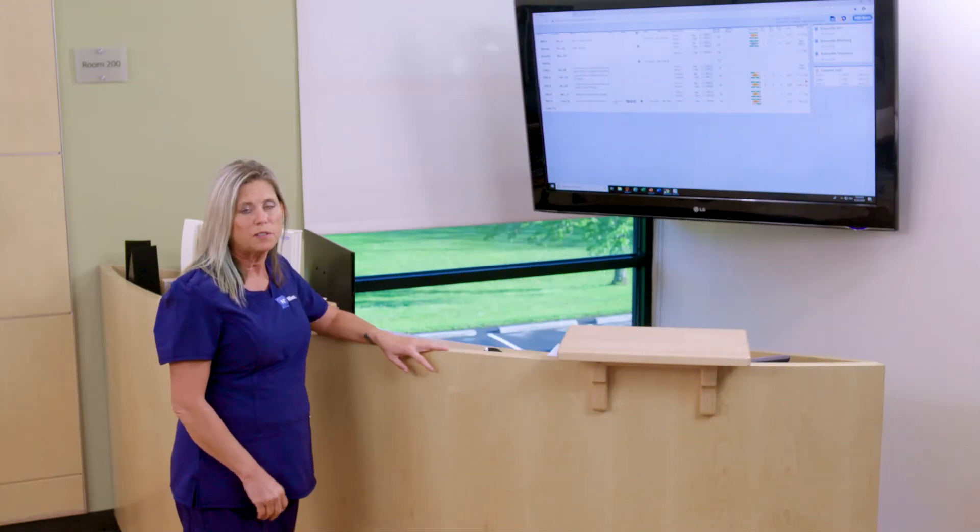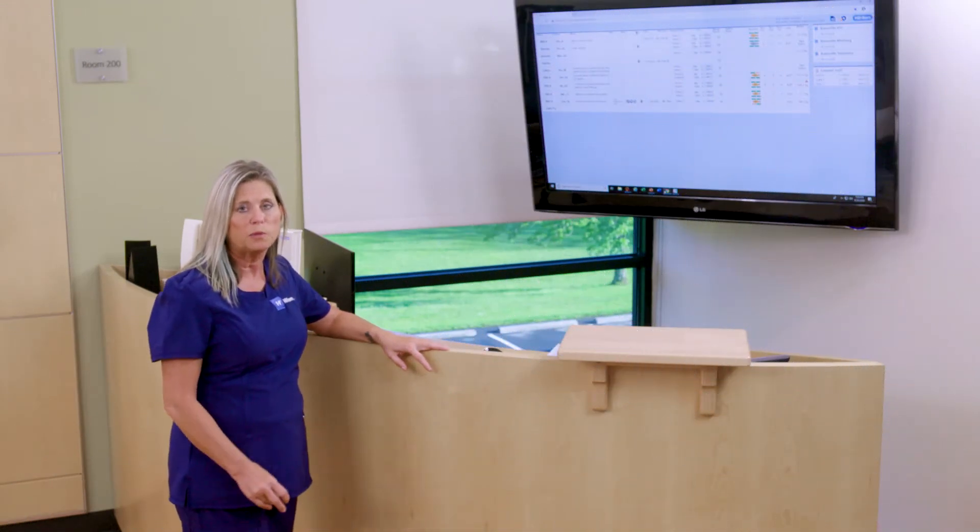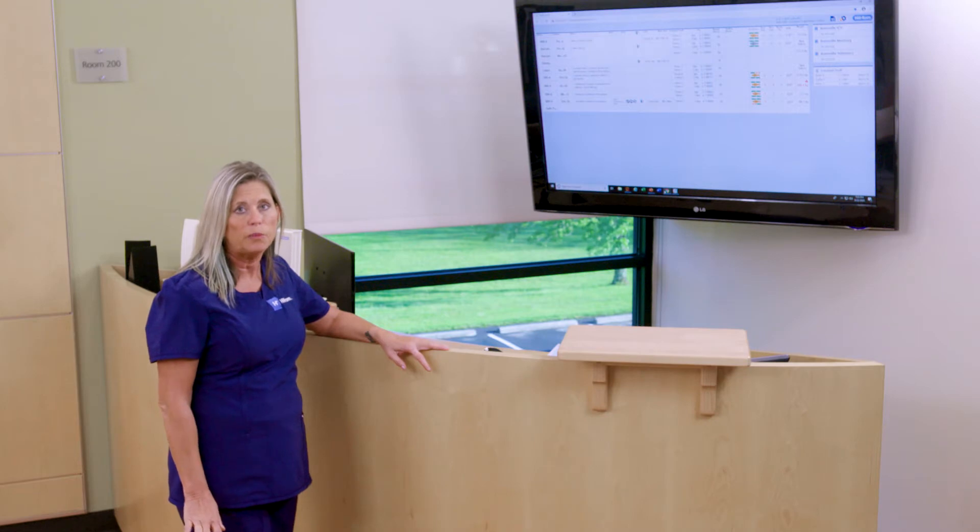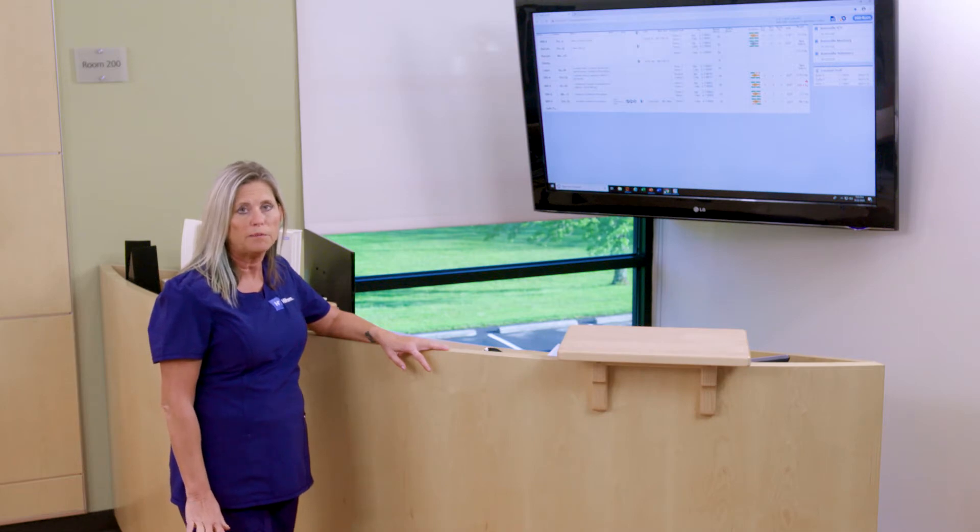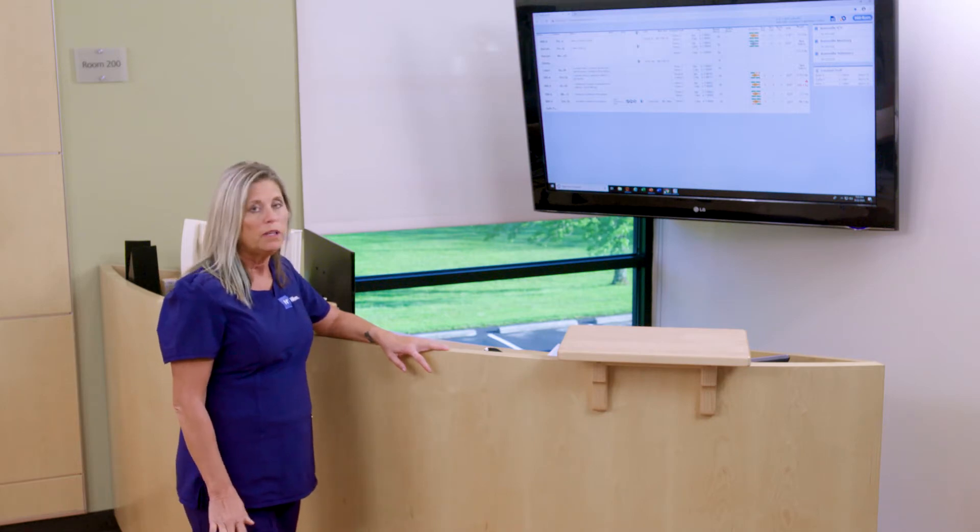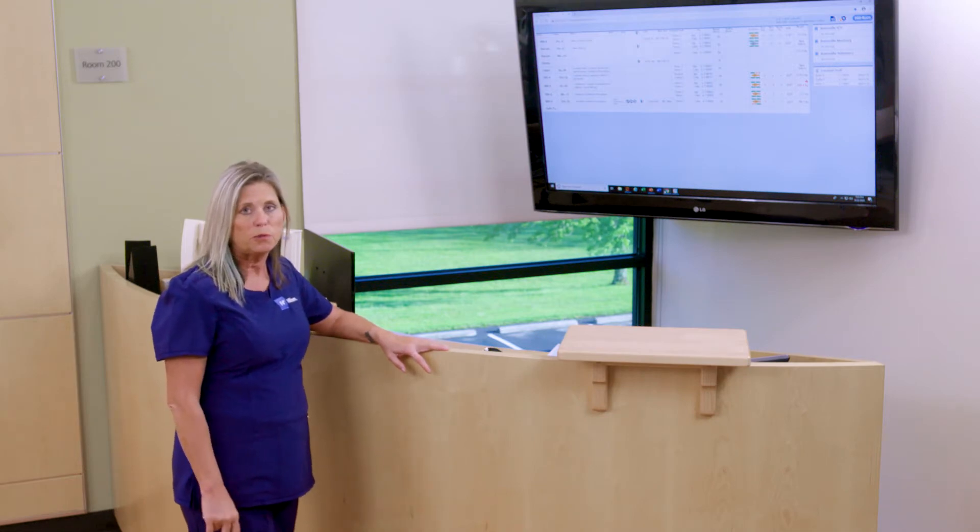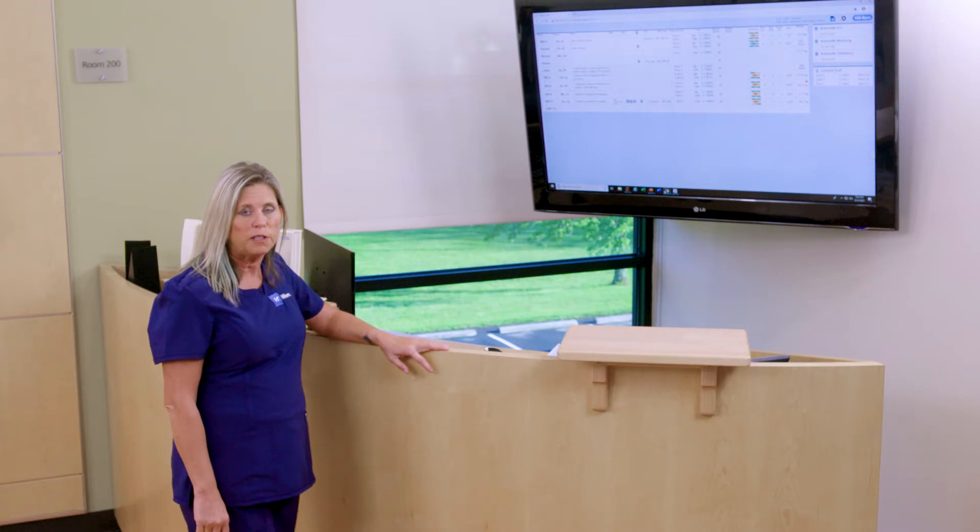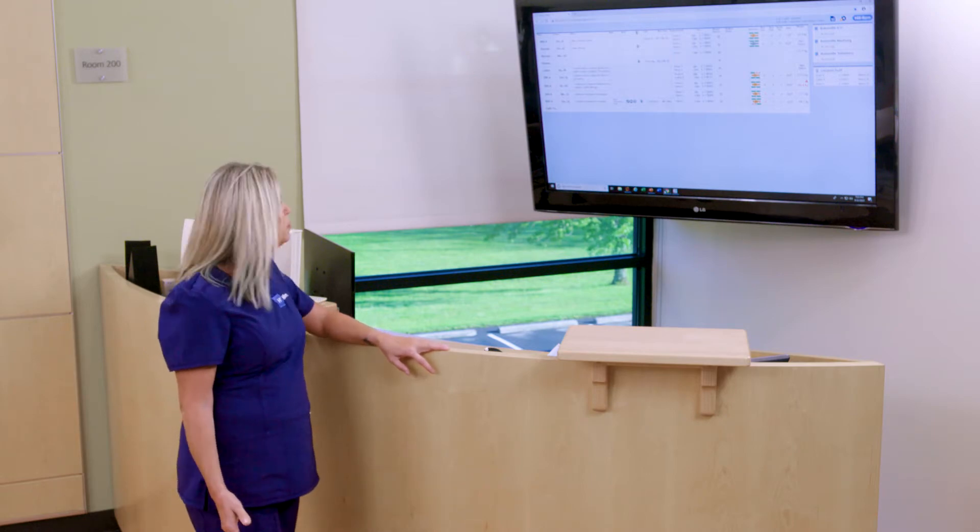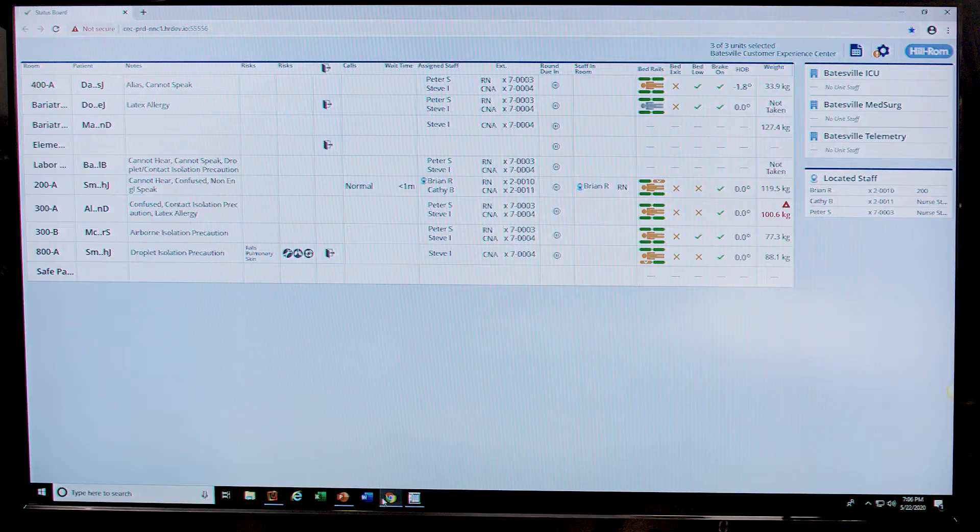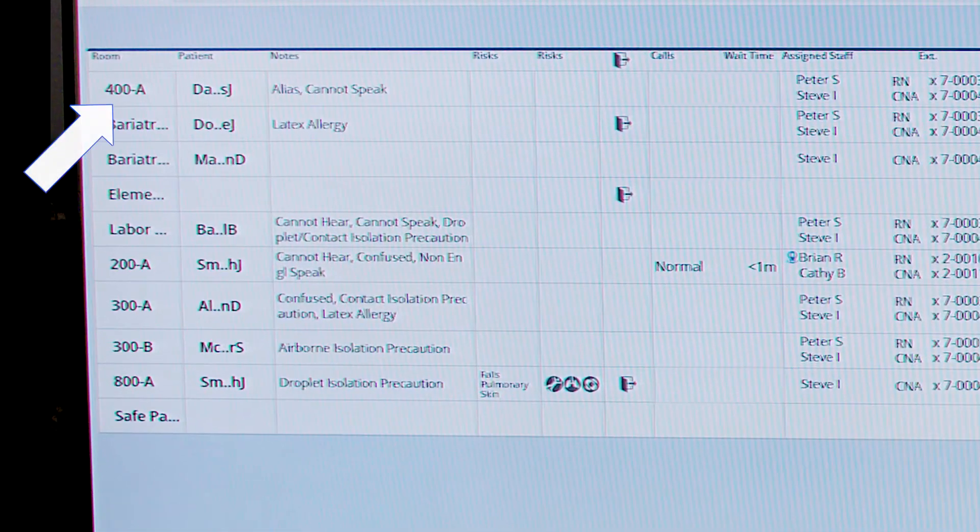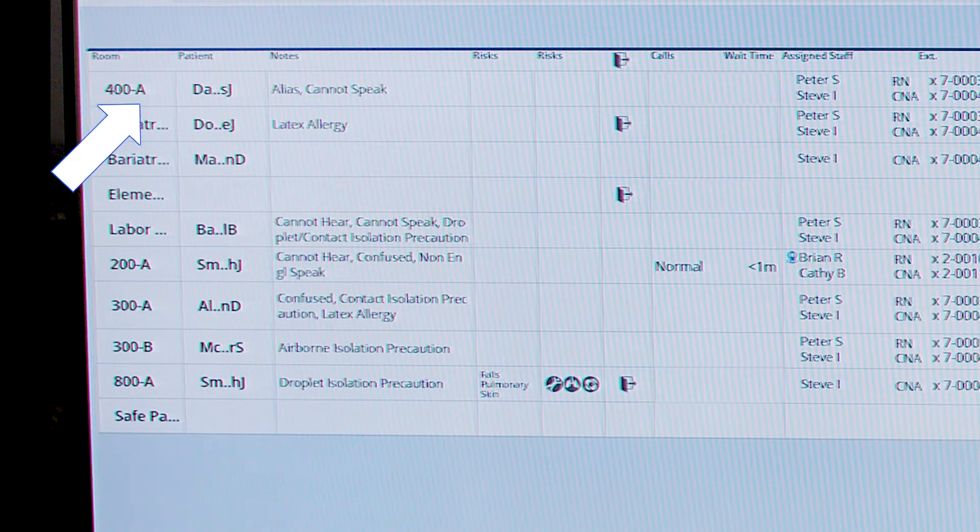We're going to review the status board, which can be located on any network PC or laptop in your unit. With the status board, you're going to have visibility around the patient safety environment. We're going to see a room number, patient name, and other key information.